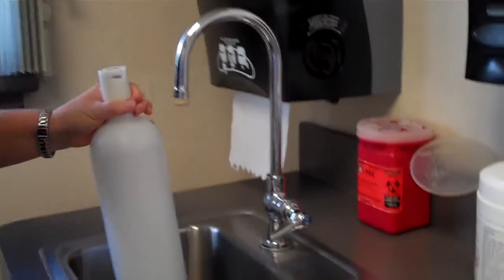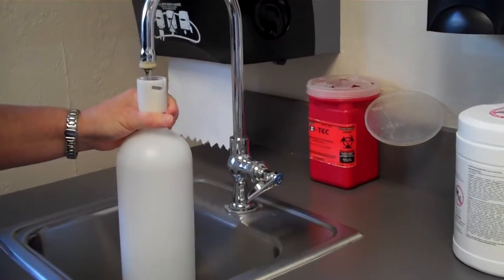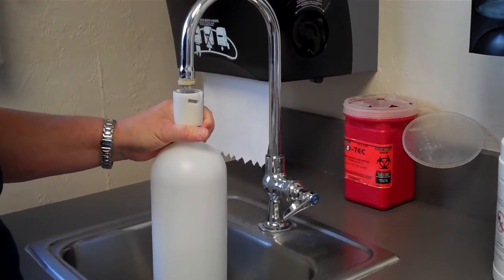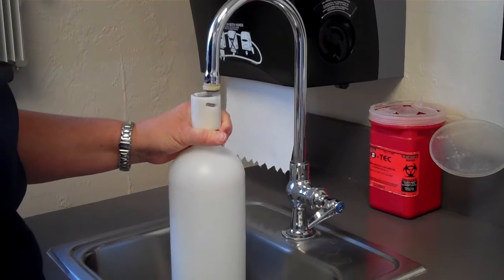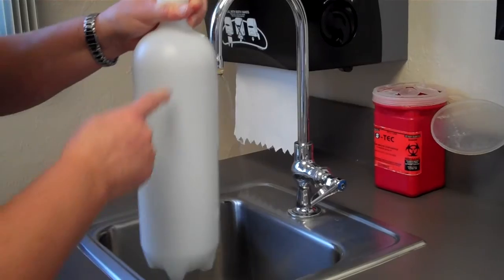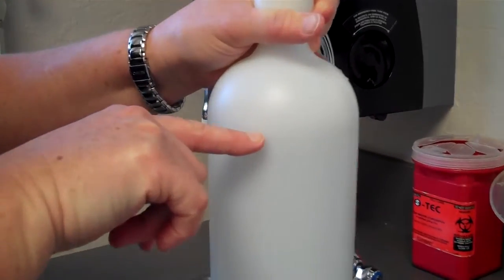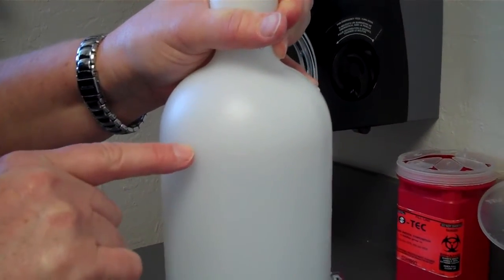Then you'll place the container underneath the sink to fill directly up to the top of the water line, which is located right here. There's a water line there. Then you will place it back onto the unit.